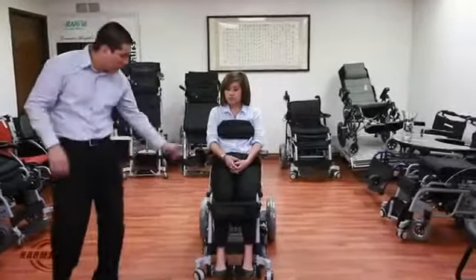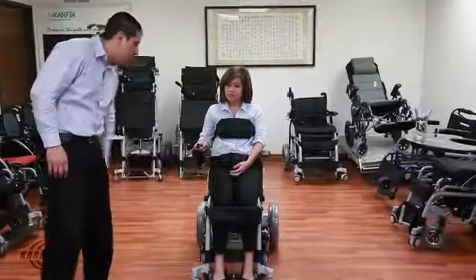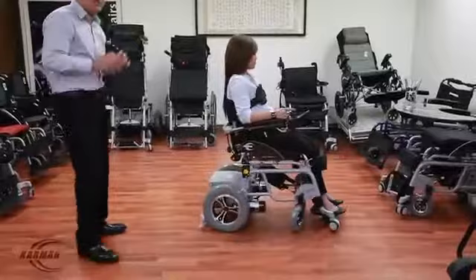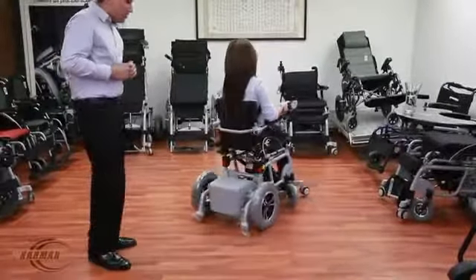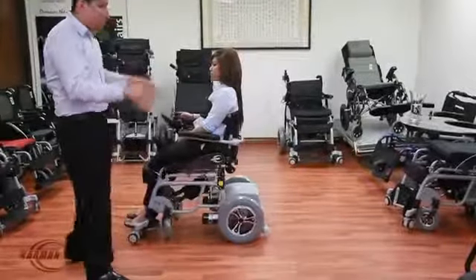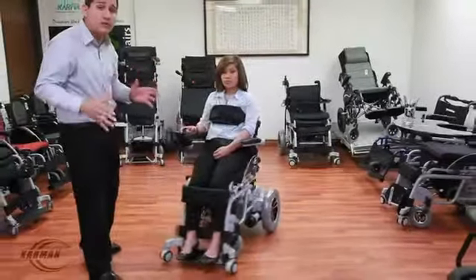Janice, why don't you go ahead and give us a tour please. Go ahead and give us a circle right here. As you see here, she's doing a complete 360, full circle, with a very short turning radius.